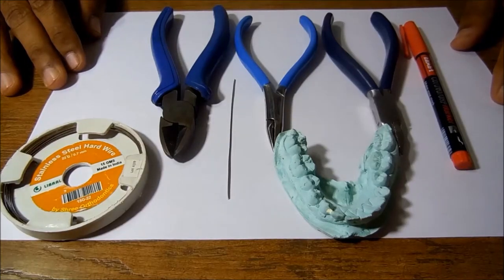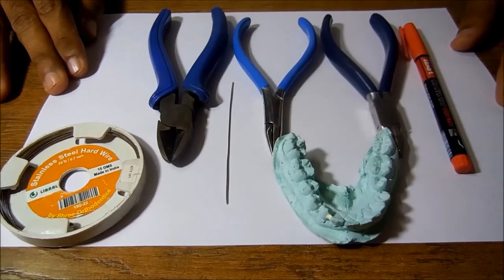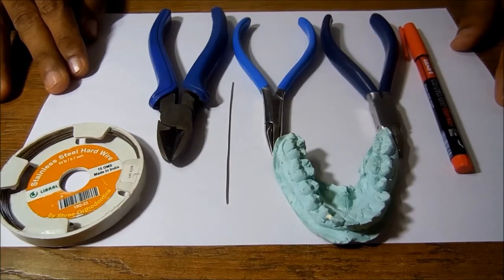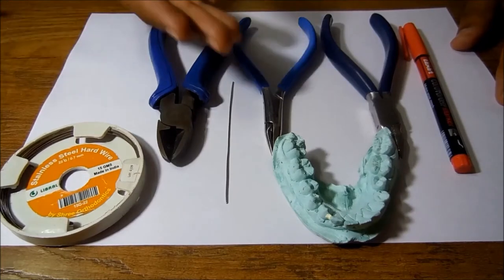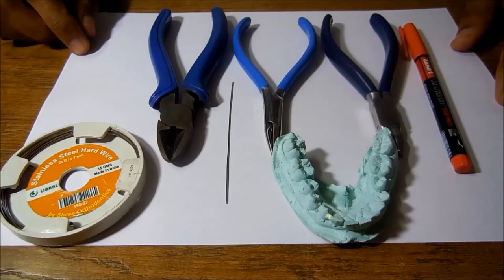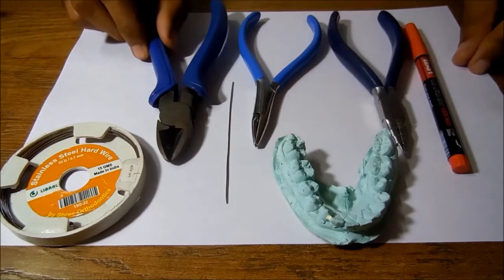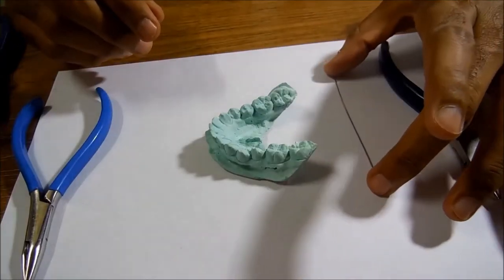Good morning friends, today I'll be demonstrating how to make an Adams clasp. It's also called a universal clasp since it can be made on any tooth. Explaining the armamentarium, what we require is a fairly straightened pliers, a 0.7mm stainless steel wire, a universal plier, half round plier, a heavy wire cutter, and a marker.